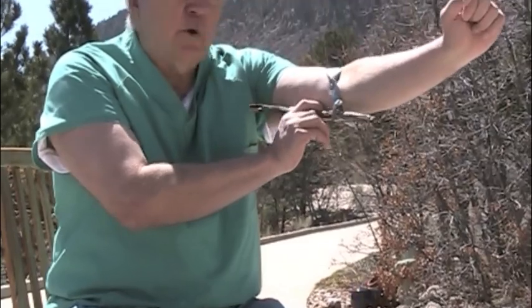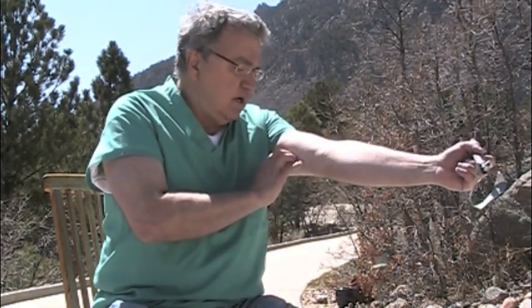Now some other things I wanted to go into: what happens if the tourniquet doesn't work? What if the bleeding continues? Because at least one person came up to me during a conference and told me that a tourniquet was tried on a person in this area here and the bleeding didn't stop. Well, that's where the anatomy comes in. If the bleeding doesn't stop, and you use the tourniquet, there's no reason why you can't use other methods in addition to the tourniquet. You could put pressure on it with the tourniquet on there.